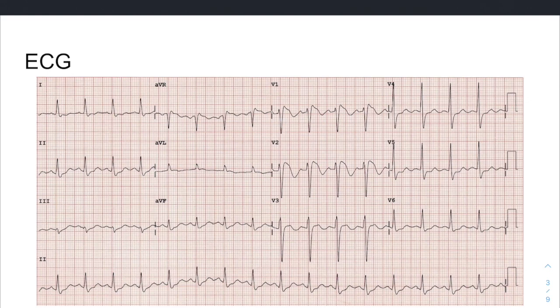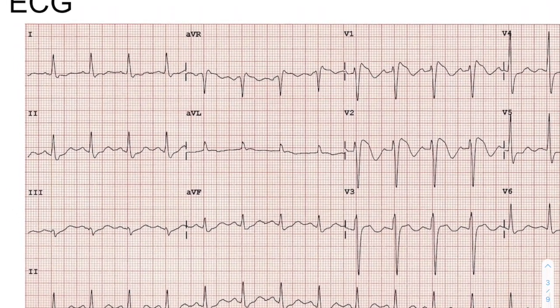Like we've been doing week in, week out, we're going to use the six-step method to interpret this ECG, and then we'll point out some of the interesting findings. We'll start with the rate and use the 300 method here. Picking a QRS complex close to a line, we count the big boxes — one, two, three — to the next R peak, giving us 300 divided by 3, so our rate is about 100 beats per minute.